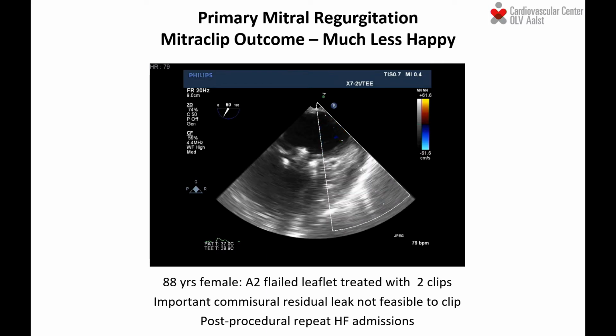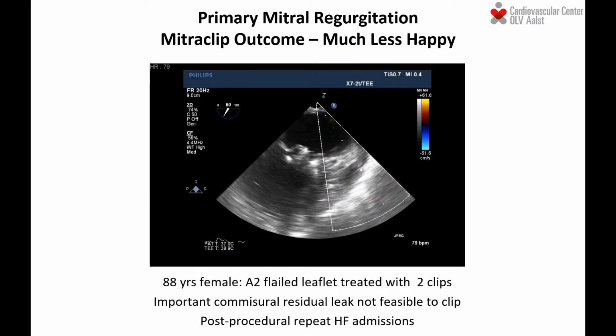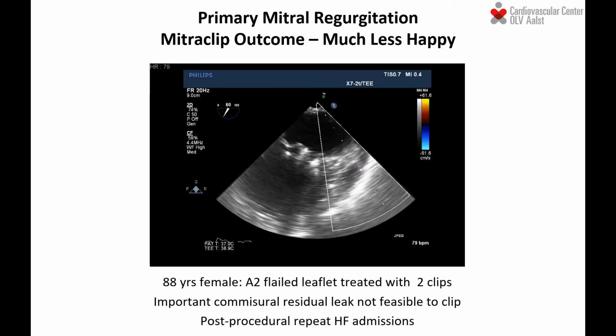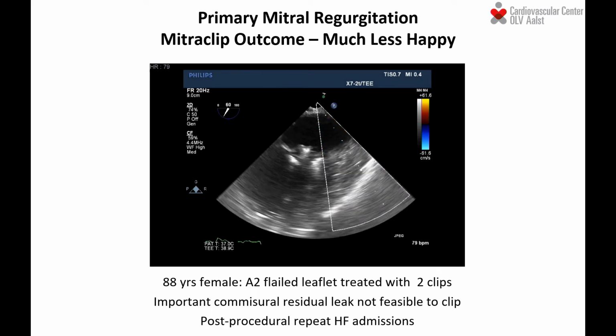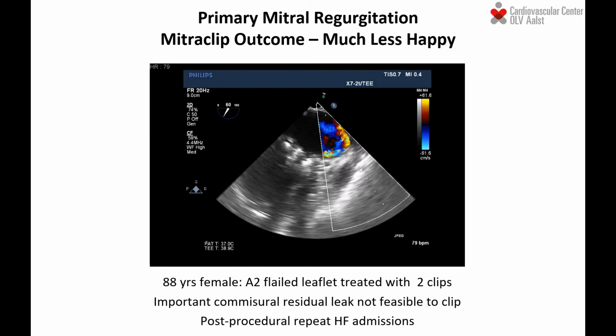In the organic, this is another case, an 88-year-old female with an A2 flail leaflet, treated with 2 clips, still with important residual leak in the commissures. We could not clip it. The patient did not do very well. She came back again several times with heart failure. She died quite soon after the clip.